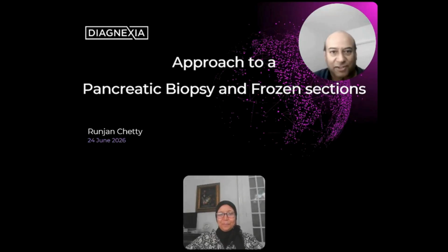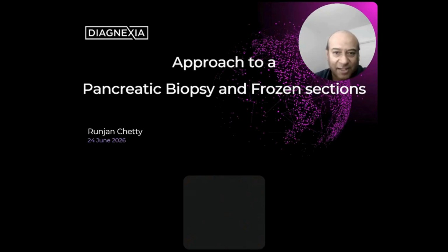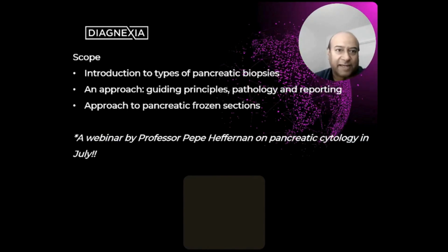It's a pleasure indeed. I think the talk was advertised as an approach to pancreatic biopsy, so I've taken the liberty of expanding it a little to include frozen sections, and I think they fit in quite nicely. So the scope of the talk today is I'm going to do an introduction to the types of pancreatic biopsies that you would encounter, and then an approach to the interpretation of these, some guiding principles that are basically in surgical pathology, whether it's biopsy or resection.